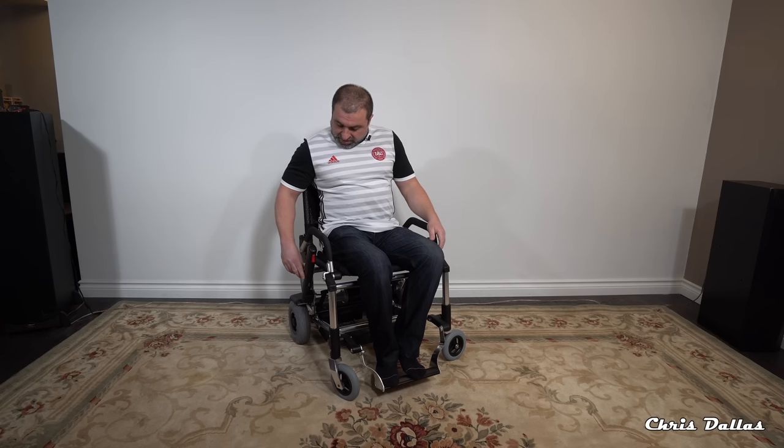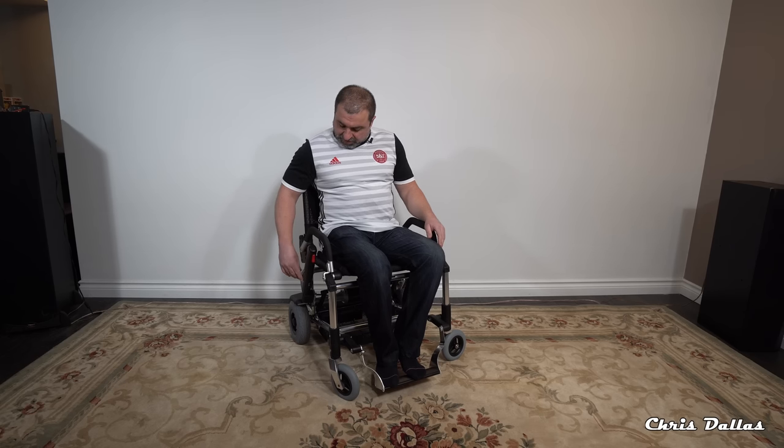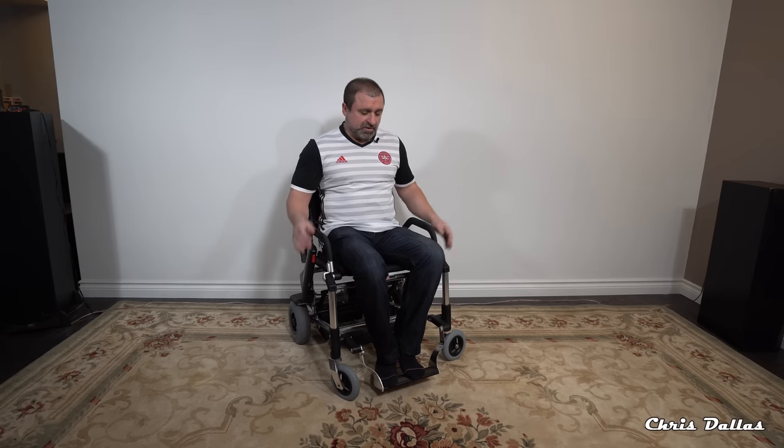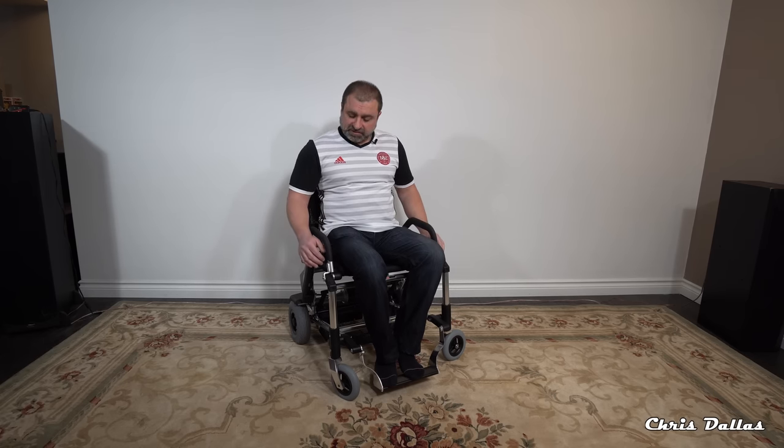It's got three different power levels. Once you turn it on you can utilize low, medium, and high. Low is a very slow speed, great for rolling around in a shopping mall or grocery store going in and out of aisles. It turns on a dime. You're not using a hand controller here — you do have to use both hands. If you're disabled in one of the two hands, unfortunately you won't be able to use this chair, but if your hands and arms are fine you can easily use it.